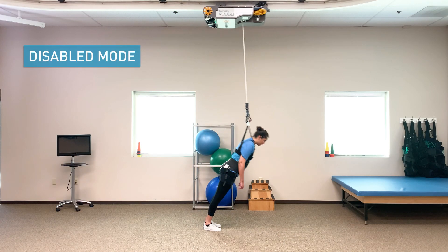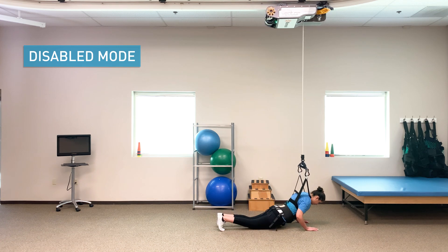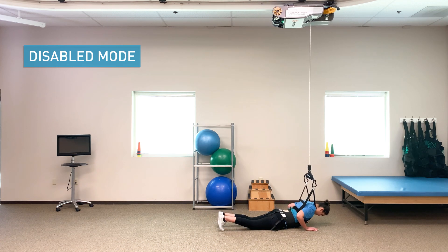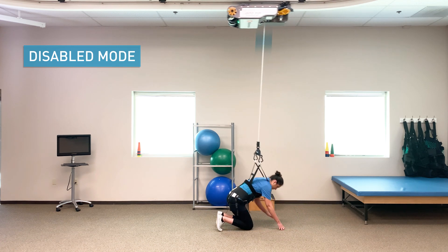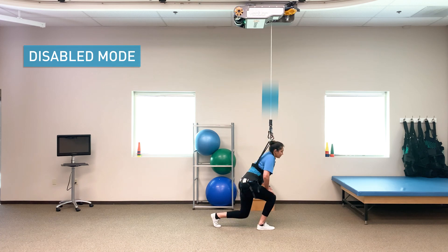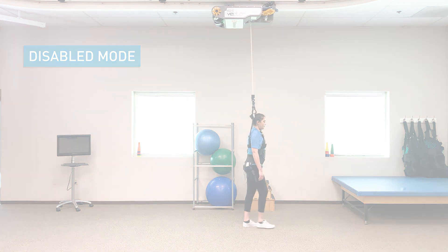Think what you could do with your patient if you knew they were safe. Reach beyond the gait belt and parallel bars — your passion and skill with Vector technology. Endless potential.